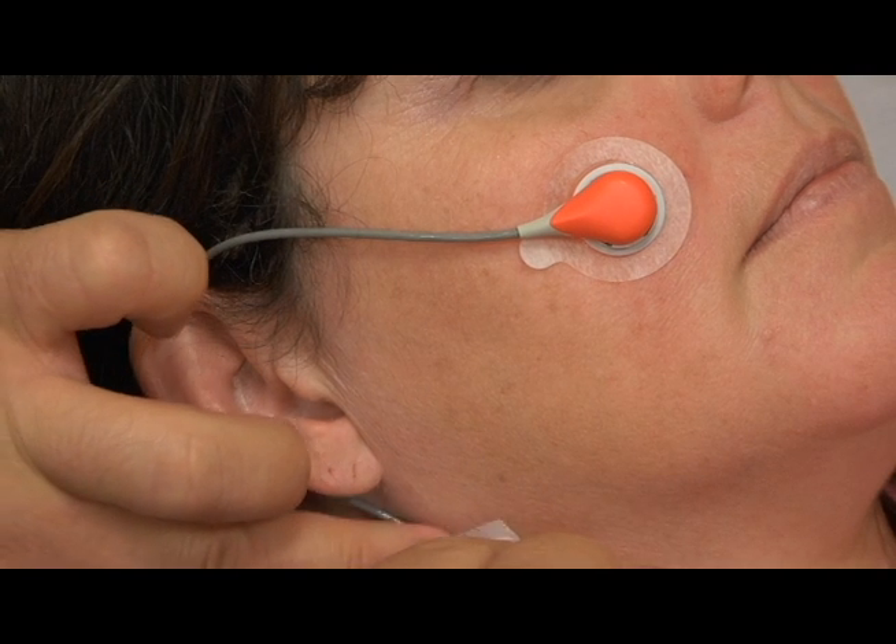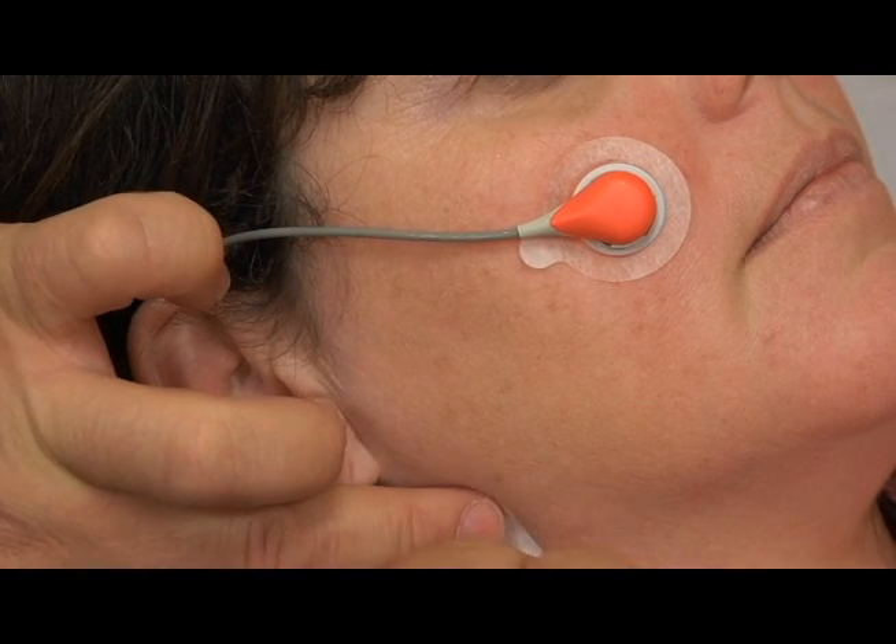For forehead or cheek placement, wrap the sensor cable once around the ear and tape the cable to the cheek.